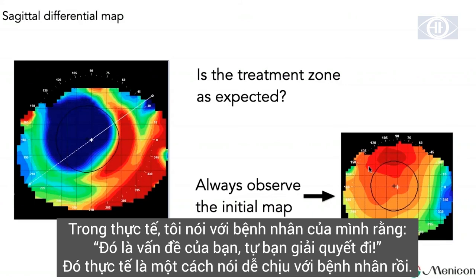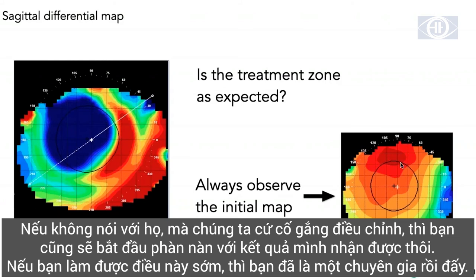If I don't say that to the patient, and I say, okay, but we tried, your power is perfect for that, and we try it, and you end up with this result, and your patient starts to complain, you have a discussion in your chair, and I try to avoid discussion. If you can do it beforehand, you are even more of a specialist as well.